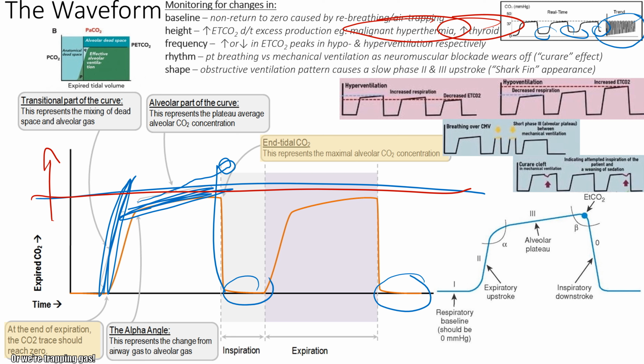And the frequency. So we can see the end-tidal CO2 is really fast over here, right? So with hypoventilation, you can see how it's going up and up and up, or you can see your end-tidal CO2 waveform being more frequent. You can get a respiratory rate off this as well. It's your best respiratory rate, right? We have the EKG patches, which use impedance thresholds and can maybe get you a respiratory rate, but end-tidal CO2 on the monitor will get you it every time. Okay, because it knows here's exhalation, there's inhalation, there's exhalation, and it can say, well, that's your respiratory rate.